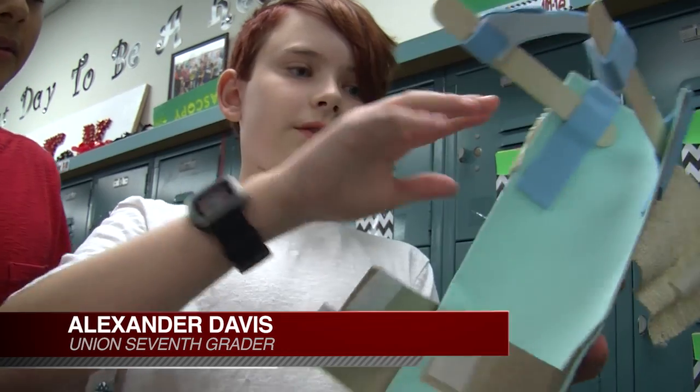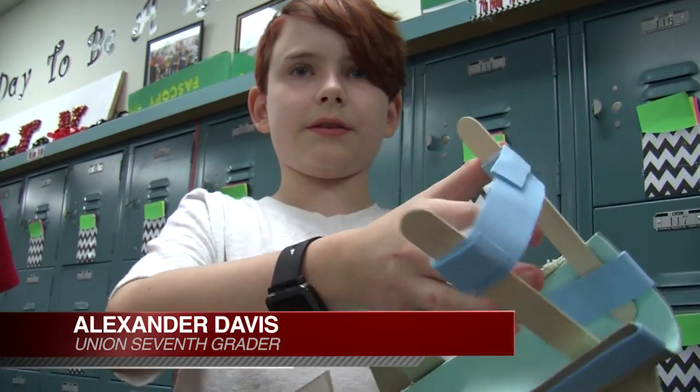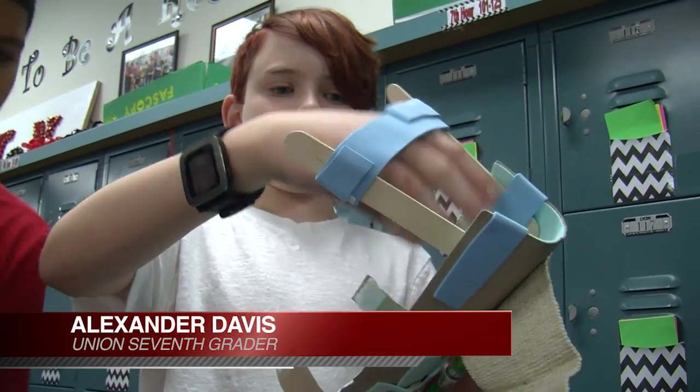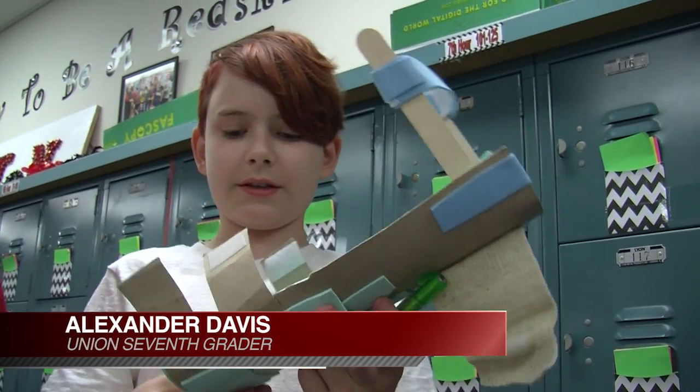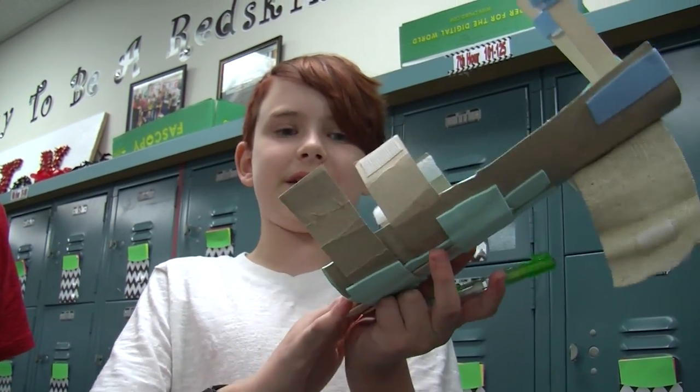We strap some in each of these straps, and this is for the back of the foot, so it's more comfortable right here. It also holds the ankle down in this part so you can't really push it down.